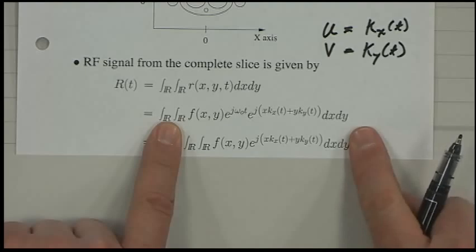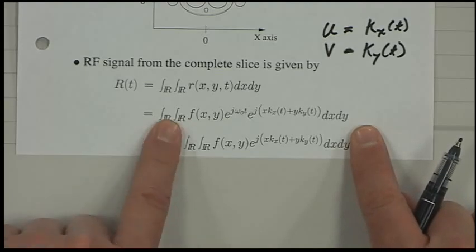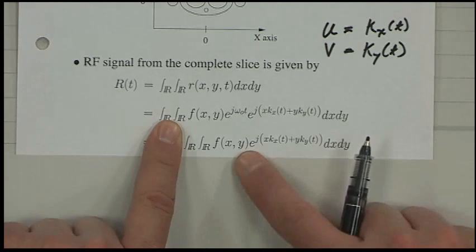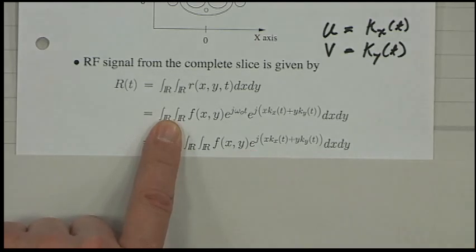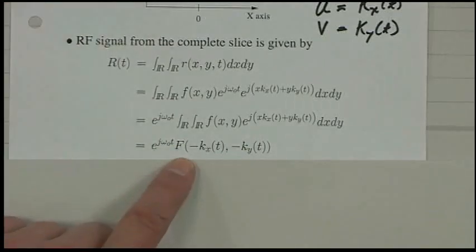So what you're doing here is, if you strip off the carrier and you measure the complex demodulated signal, this is going to be a complex number, and that complex number is the continuous space Fourier transform of the underlying 2D slice of the person. It's really actually quite amazing, isn't it? So guess what? This is really just the Fourier transform.